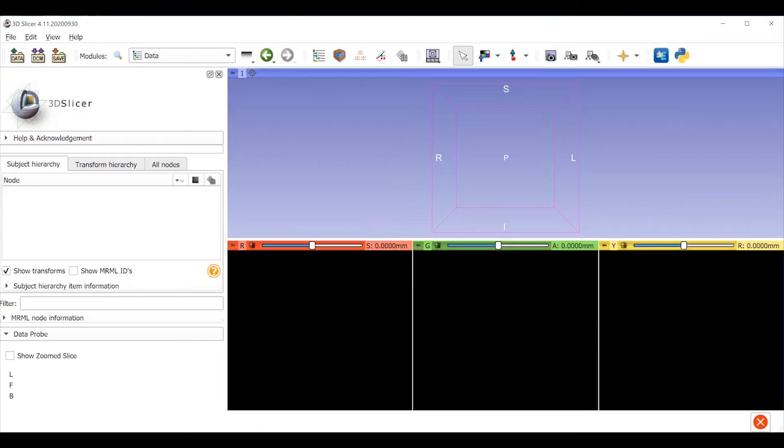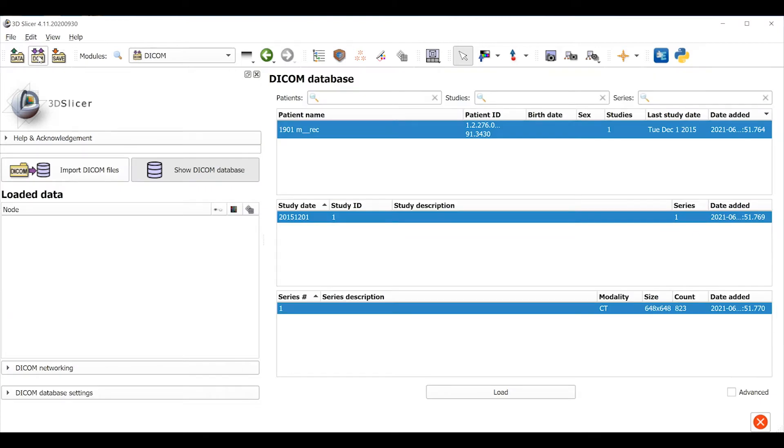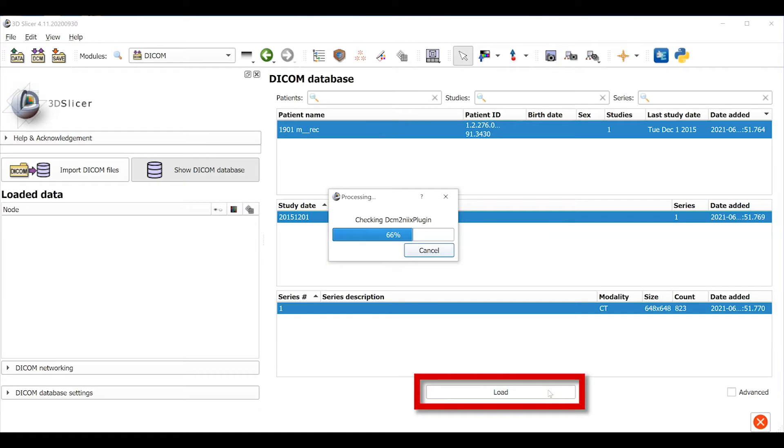Let's start by loading our image data. Select the Load Dicom icon in the upper left, and this will pull up our Dicom directory, where I've already imported a MicroCT of a mouse skull. Let's select that volume and then select the Load command.